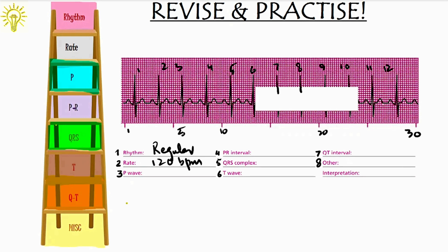I can see the P waves. The P waves are normal in shape and every P wave is followed by QRS, meaning sinus rhythm. So, P wave is normal. The PR interval from start of P to start of Q is around 0.12 seconds which is normal. The QRS complex is narrow, barely 2 small boxes. So, less than 0.08 seconds. T wave is normal. The QT interval is normal within range. There is no other anomaly I can see. So, it is sinus tachycardia since the heart rate is greater than 100.